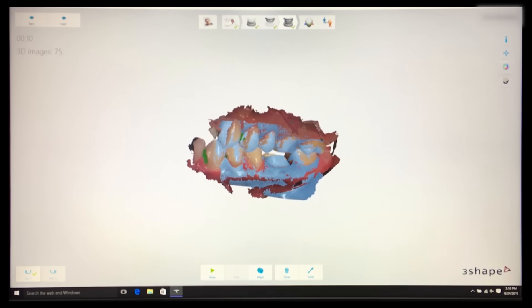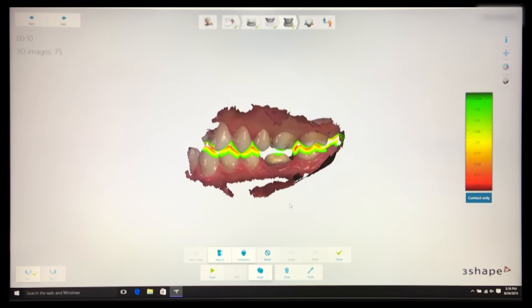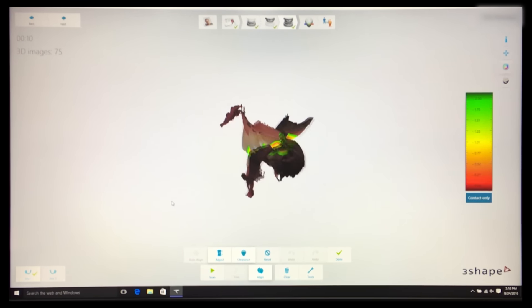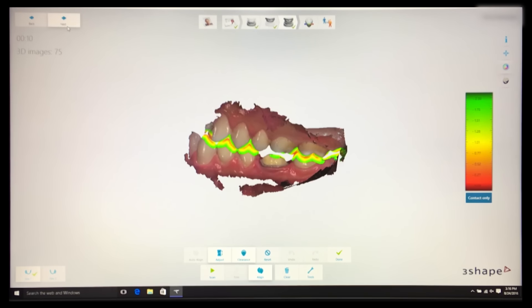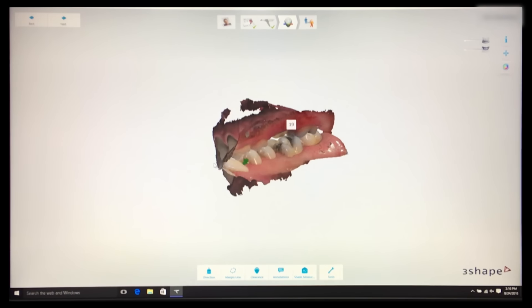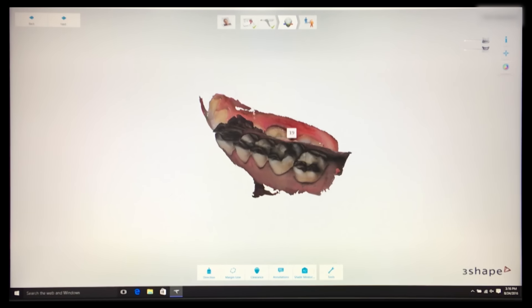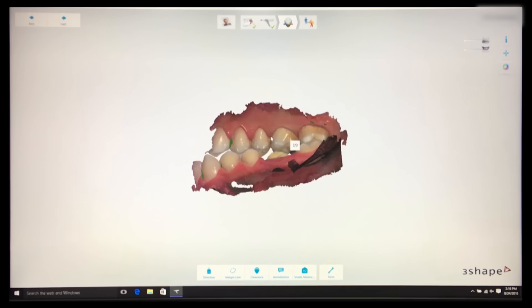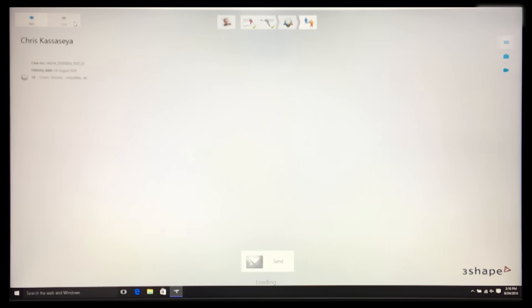A helpful feature in the bite view is having the ability to check the exact clearance between the prep and the opposing. I highly recommend reducing more now if you need to, prior to submitting the case to the lab. Over the last few years, we've seen a steady increase in the number of digital impressions getting sent to the lab, which means many more dentists are trusting and embracing the accuracy that this new technology offers.